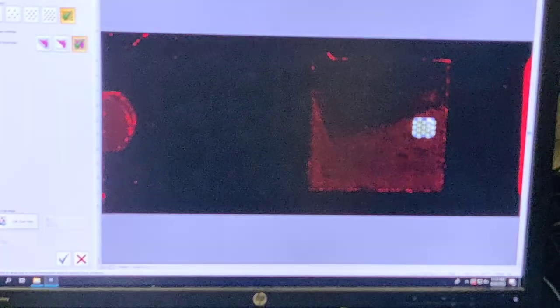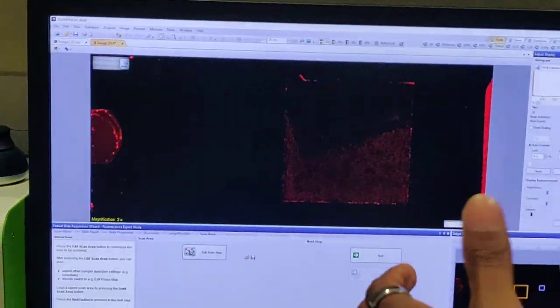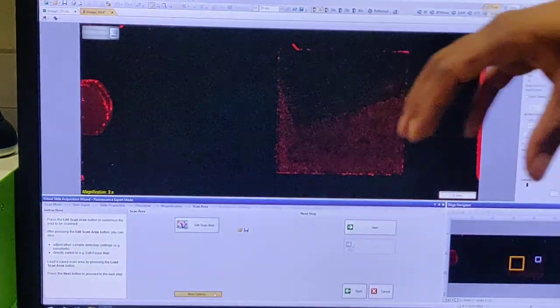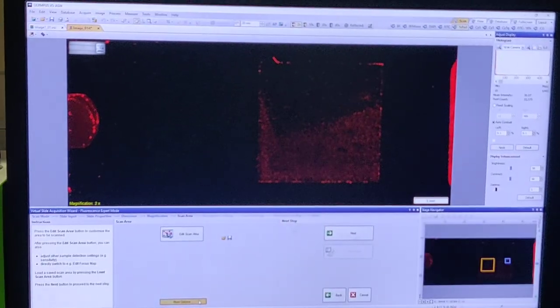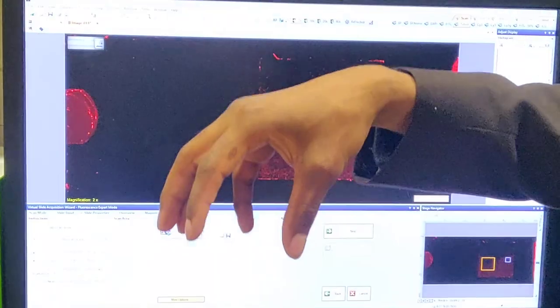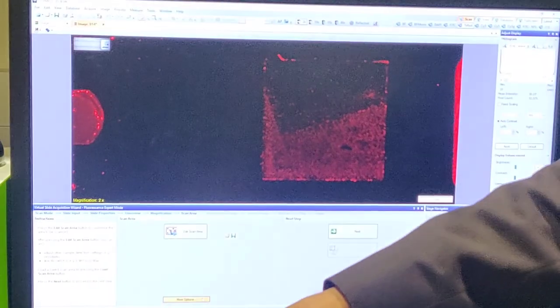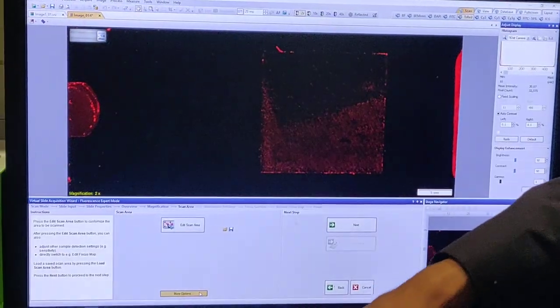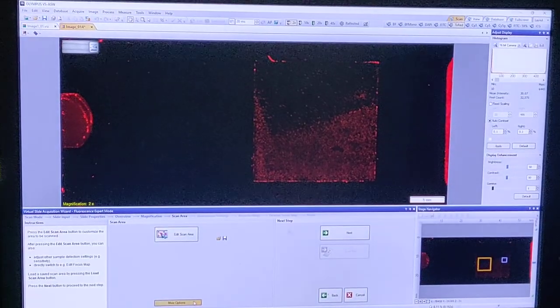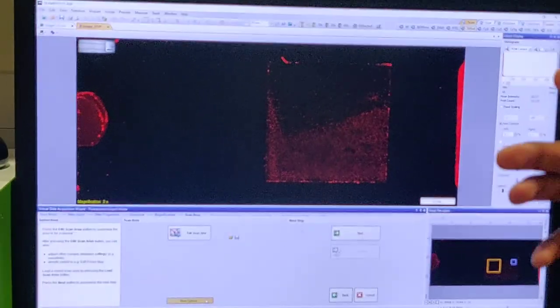I need more focal points because these are individual cells. There is an important feature regarding the imaging protocol. One option images one color at a location, keeps scanning that same color across XY, then switches. The other option does all three colors at the same XY position, then moves to the next XY and repeats. The second protocol is very slow and it also hurts the microscope, because changing color means changing the filter wheel — you hear that clicking sound each time.